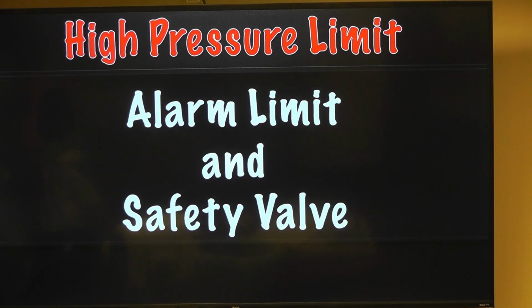In volume ventilation, your high pressure limit serves two purposes. It's an alarm limit to make noise and yap at you, but more importantly it's a safety valve. Back to my analogy of me and my 8-year-old, right? You put me on 500 cc's of tidal volume, my peak inspiratory pressure is going to be 20. His is going to be 55 if we move that limit, but we set our limit at around 30, right? So it's going to hit 30, and it's going to dump the exhalation valve on him. This is the reason we have to set high pressure limits appropriately, and the reason we go in and set our alarm limits appropriately.